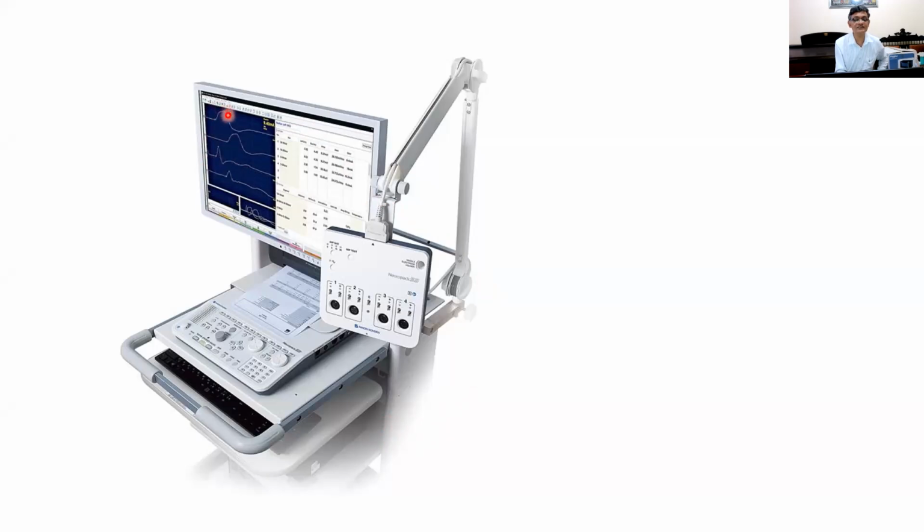You can see the original top two lines, the action potentials are very similar in shape. The main difference is the latency period. The lower two are from a different nerve, maybe the ulnar nerve. You see the latency periods are different, but the wave height and form are very much similar, with a slight difference here, but that must be from the ulnar nerve.